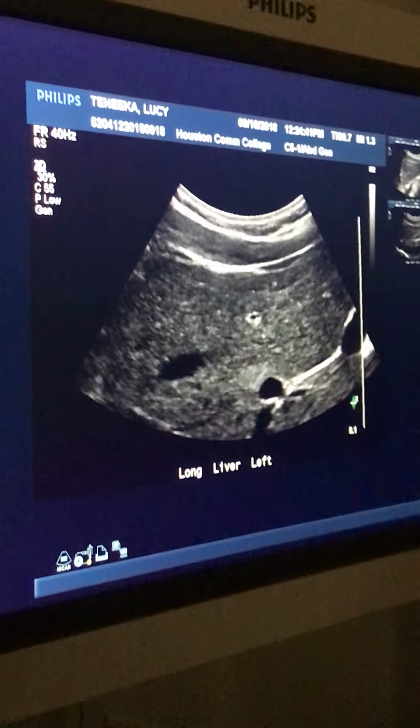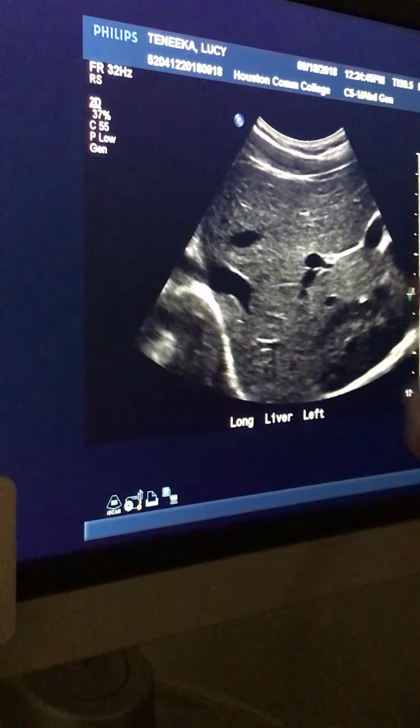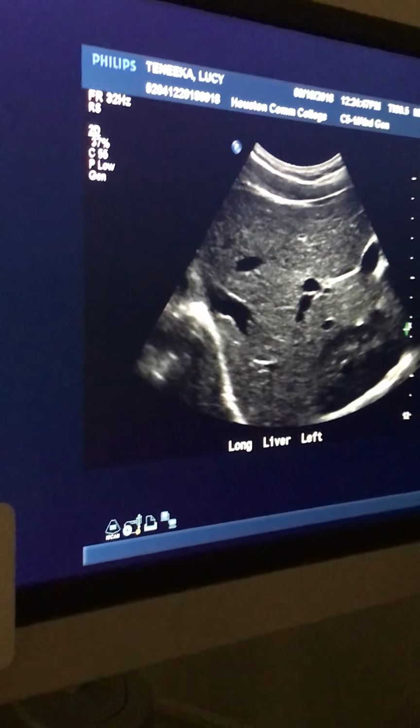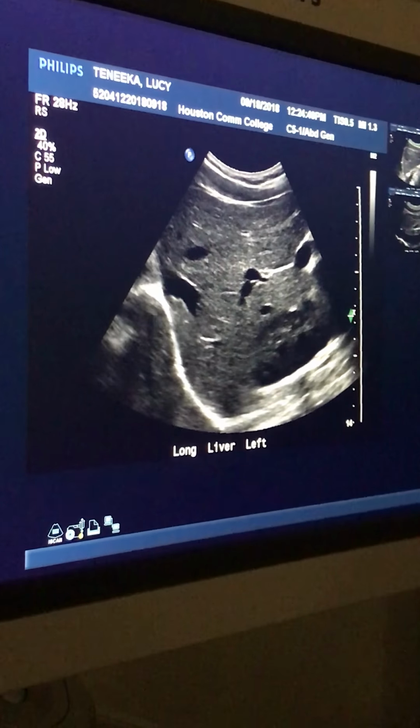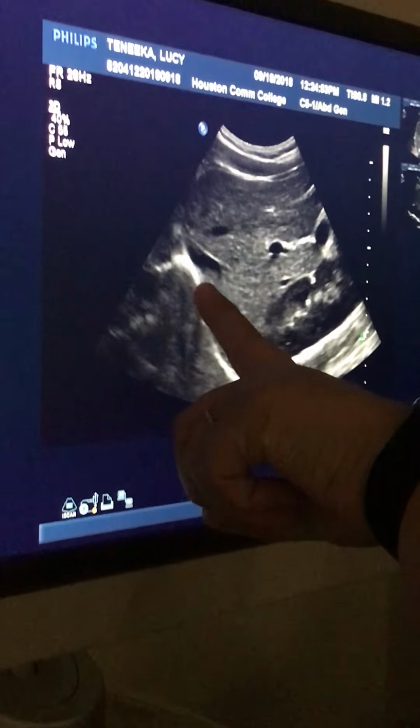But what do I have to do? Increase my depth. Yeah. And what do we see attached to the right portal vein to the gallbladder? Main lobar fissure. And that's so you can see her gallbladder. Gallbladder, right portal vein. Nice. Kidney. So clear. What's this here?